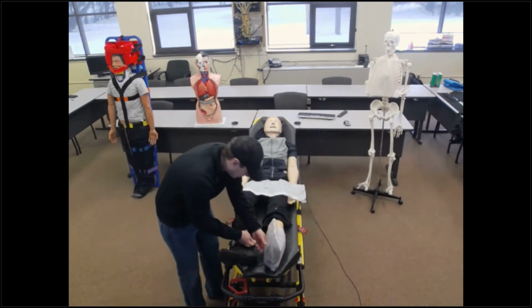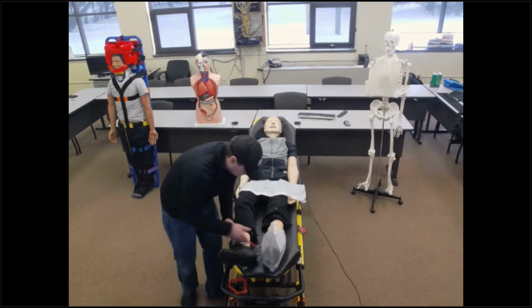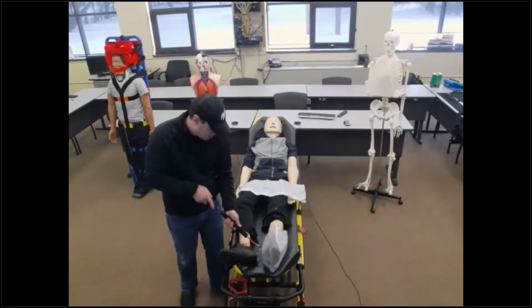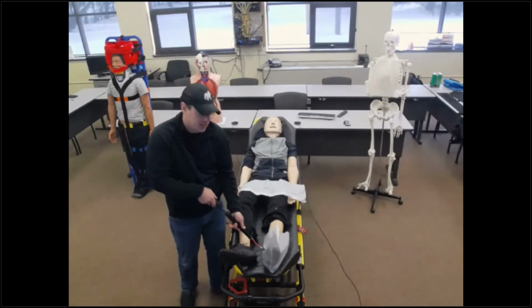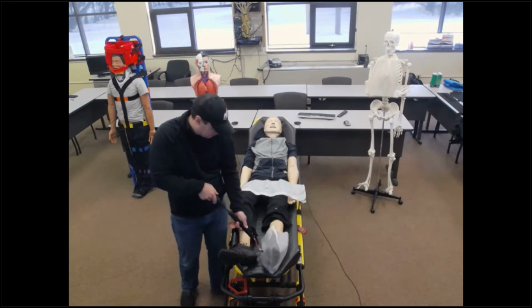Make sure that you're nice and snug inside. And then start pumping. This generally takes a little bit because you got to pump quite a bit of air into there. You can see that it's starting to fill up, it's starting to form around that patient.